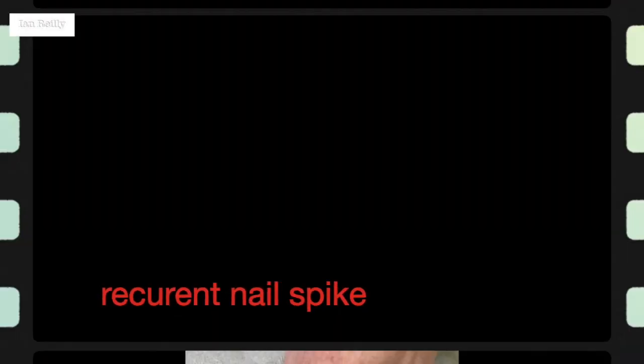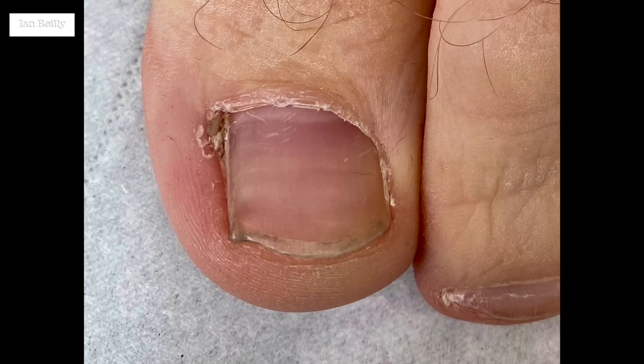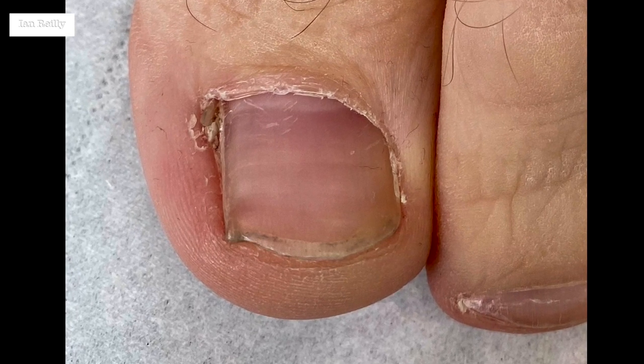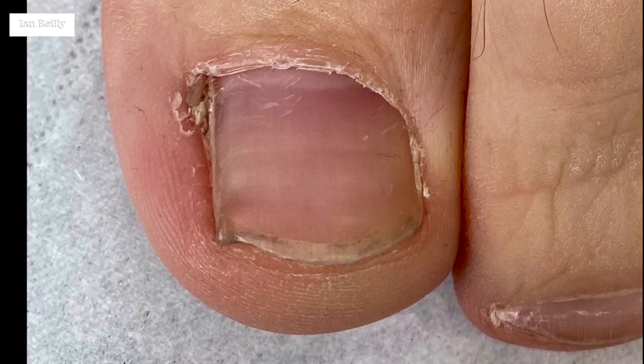This young guy came to see me with a recurrent nail spike. He'd had nail surgery done about 10 years ago, done very well from one of the local podiatrists, and then somewhat bizarrely a couple of years ago a spike had started to form. Here's a close-up of it. This had been present for about two years, was a bit of a nuisance to him, so he came through to me for a revisional procedure.